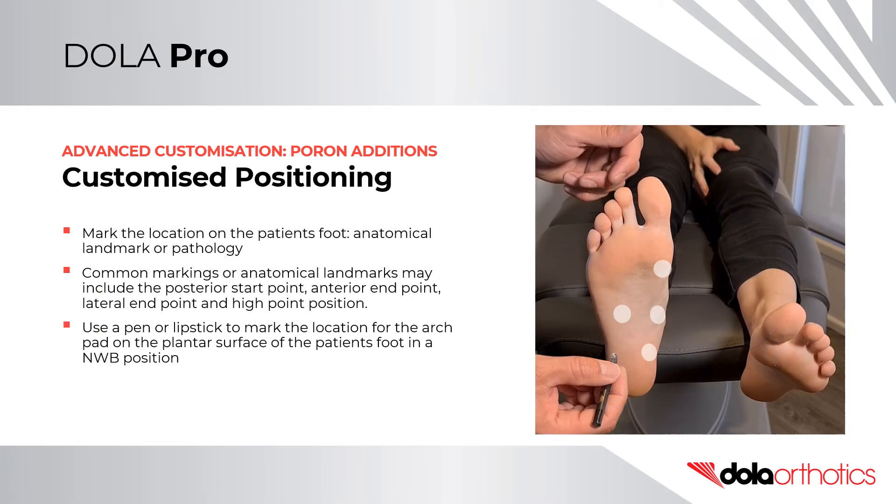For a custom position, mark the position required on the patient's foot and transfer it to the orthotic. Common markings or anatomical landmarks may include the posterior start point, anterior endpoint, lateral endpoint, and high point position. Use a pen or lipstick to mark the landmarks on the plantar surface of the patient's foot in a non-weight-bearing position.